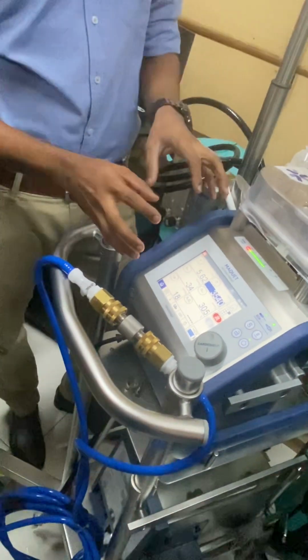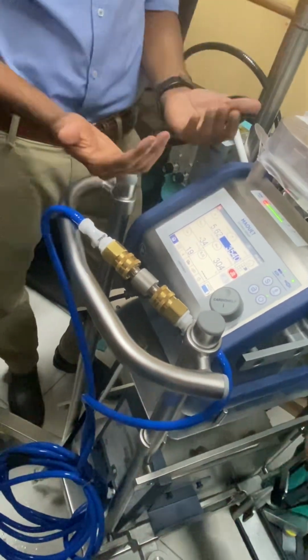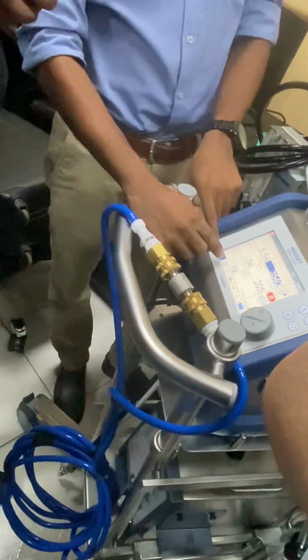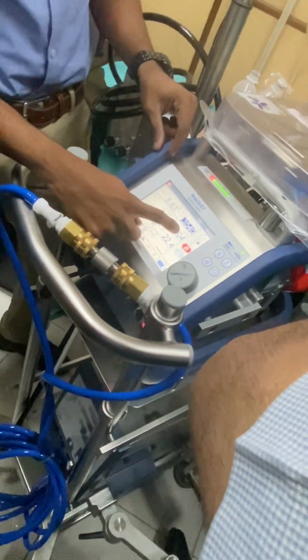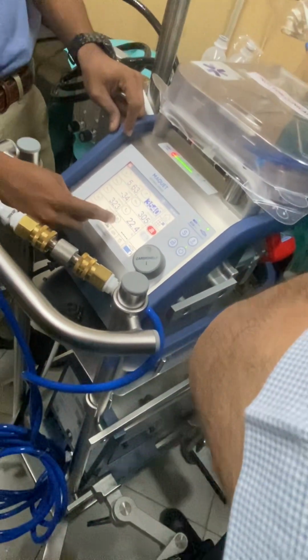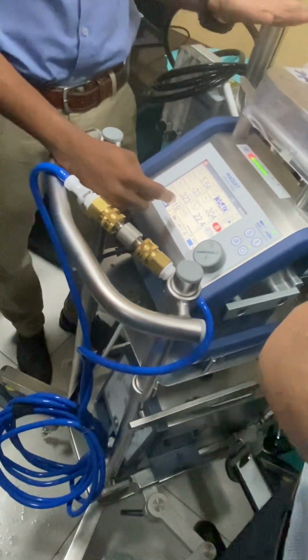On the home screen you will only see the most important or highest priority factors. If you want to know anything technical, then go to this tab. Here you can see all the pressures: pre-pump, post-membrane, pre-membrane, temperature, arterial saturation. Now we haven't connected that. That will be connected at the last stage.